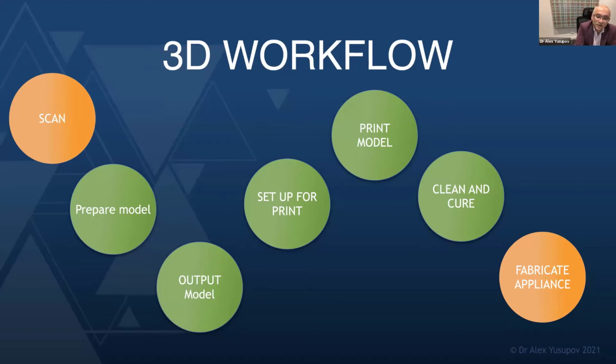And what I want to do today is, rather than me talking about hypotheticals, I actually want to take a scan and show you how we prepare these models in-house, how we print them and what we do post-printing, and then also give you maybe some tips and tricks about how to set up 3D printing in your own office to make it really high volume, really reproducible and efficient, because until you do that, it is going to be a little bit haphazard.